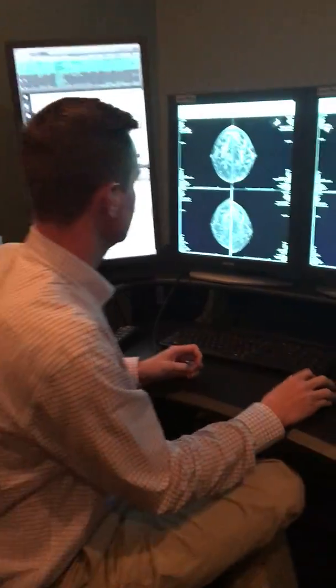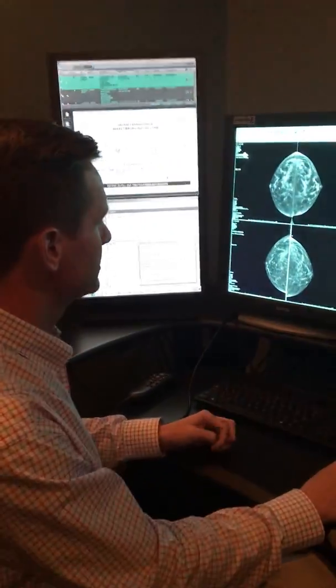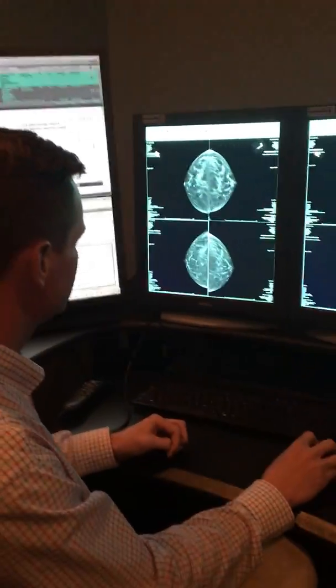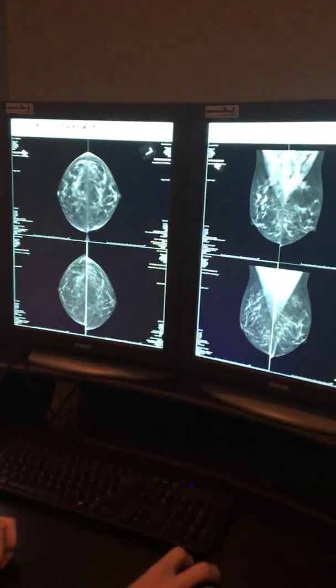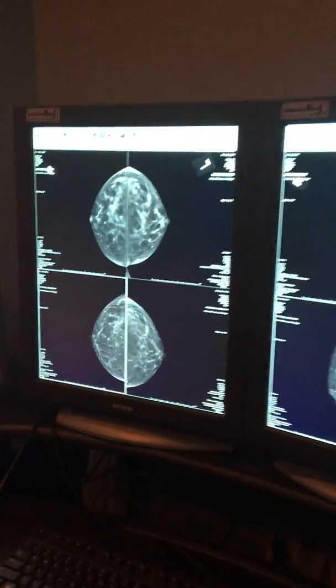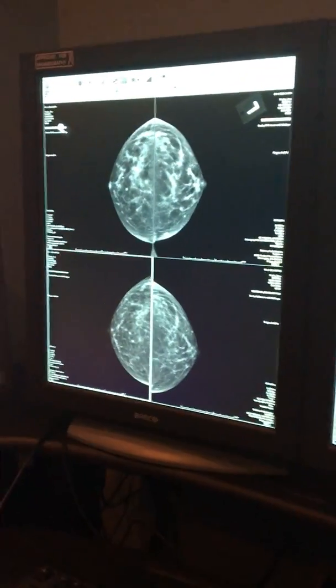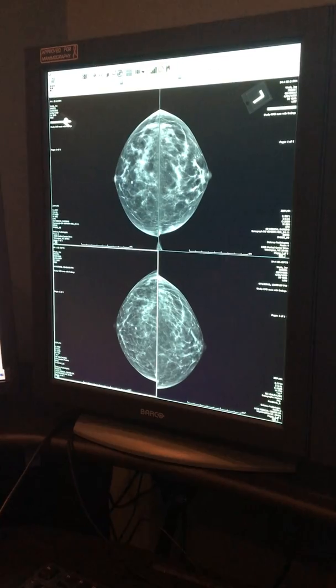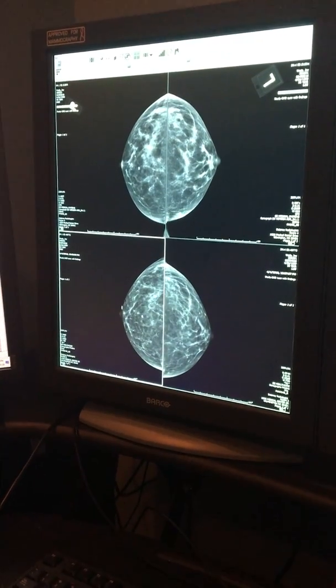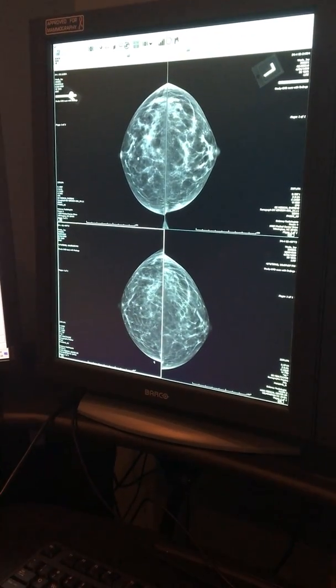Over time your breast density will decrease as we get older — that's a normal change that happens. When we're talking about breast density, let me show you what we're talking about: this white tissue here. The darker tissue is the normal fat, and this is the skin right here.